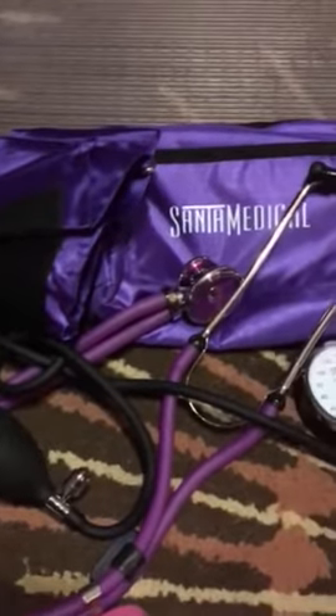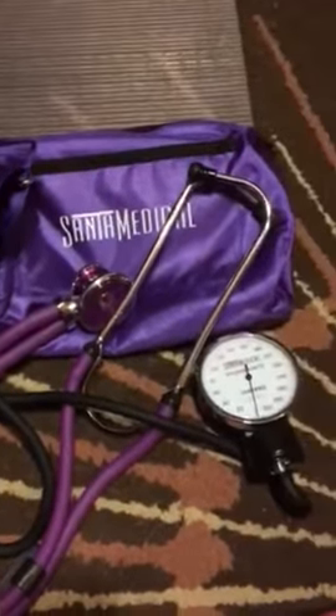This is the Santa medical... there's a word for it, I can't say it, it's this word. I'll just say blood pressure reading set.